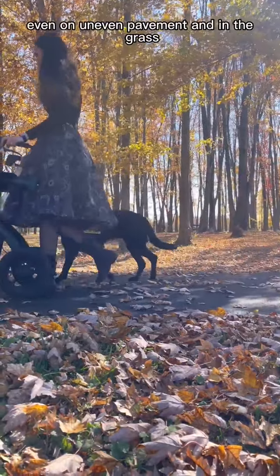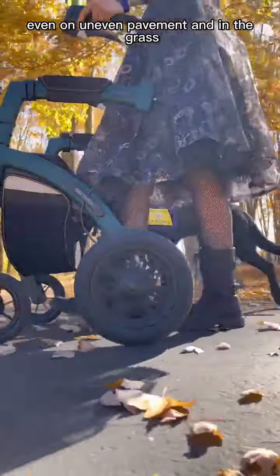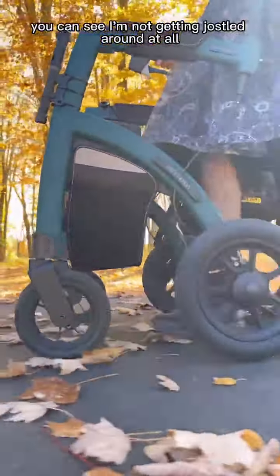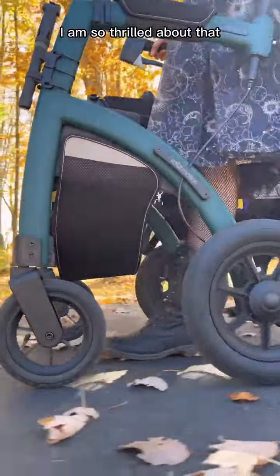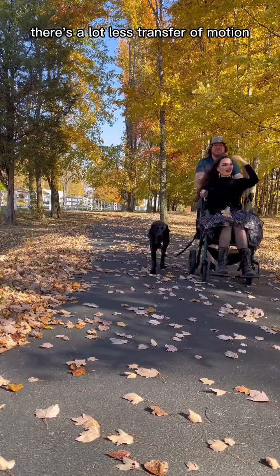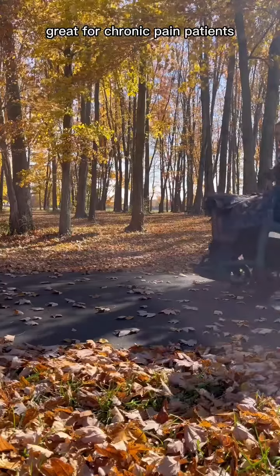It rolls incredibly smoothly, even on uneven pavement and in the grass. Here's a better shot of that — you can see I'm not getting jostled around at all, I am so thrilled about that. It's very comfortable to ride in as a wheelchair with a lot less transfer of motion, which is again great for chronic pain patients.